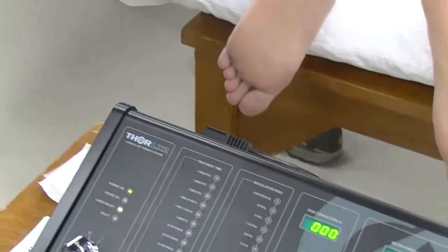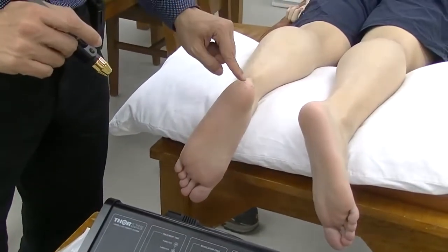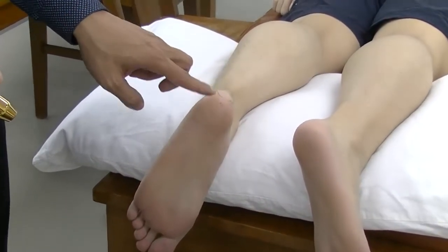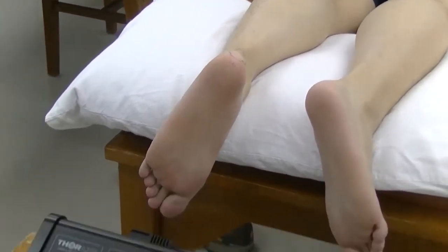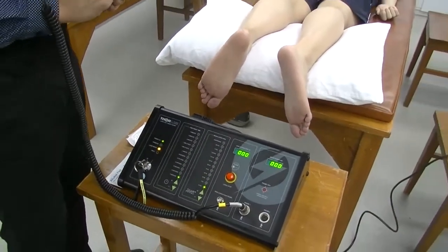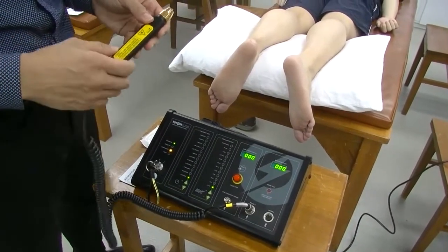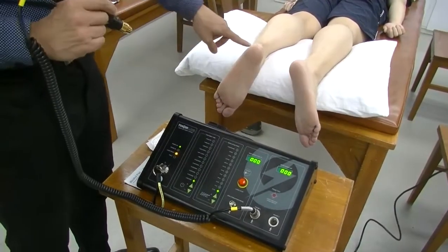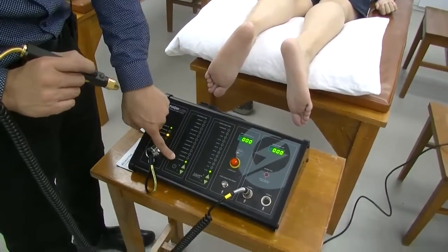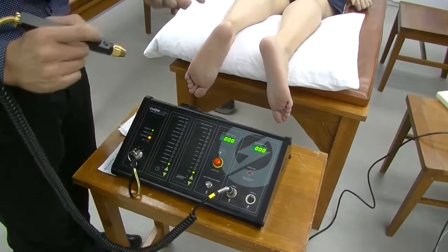We need to treat three different spots. Each spot should be around 1 centimeter away from the wound edge and approximately 2 centimeters apart from each other. For the dosimetry, each spot requires around 0.52 joules. With an output of 0.2 watts, we need approximately 2.5 seconds per spot. Since the closest discrete time option is 5 seconds, we split it to cover two spots within that interval, counting manually.